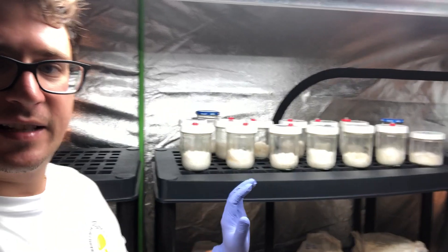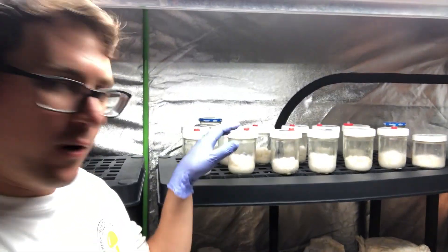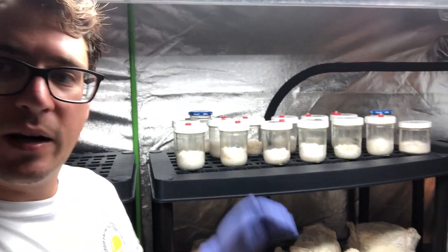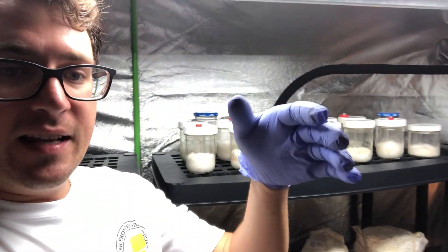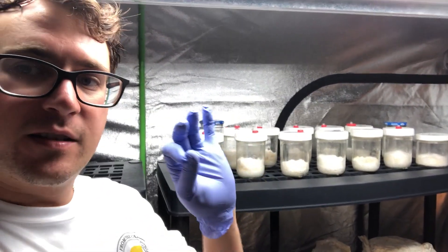One of the key things about cordyceps is when you transition it into light, it should turn orange within 24 to 48 hours, so I'll keep you guys posted on that. As I was bringing in those trays from the cart, I found some contamination.